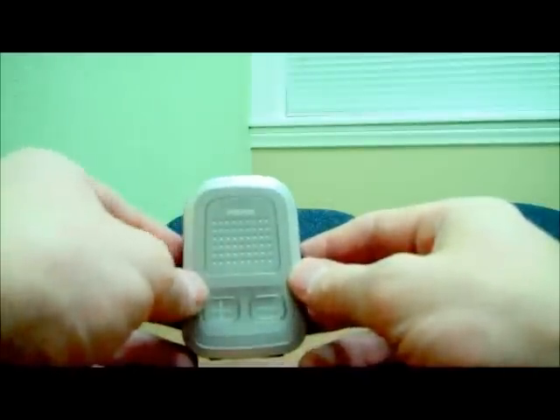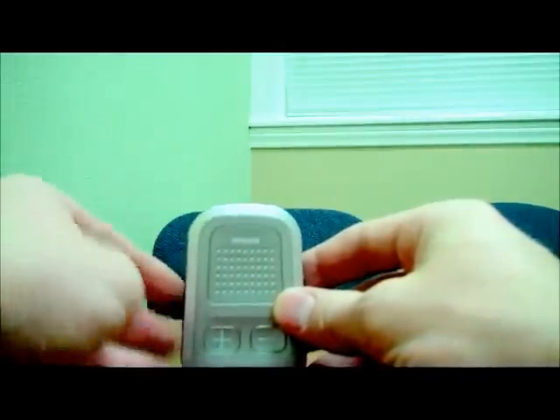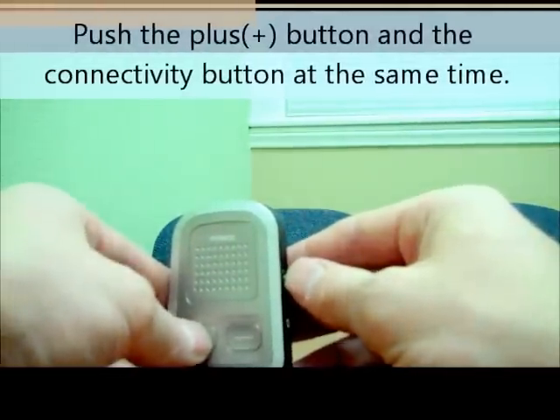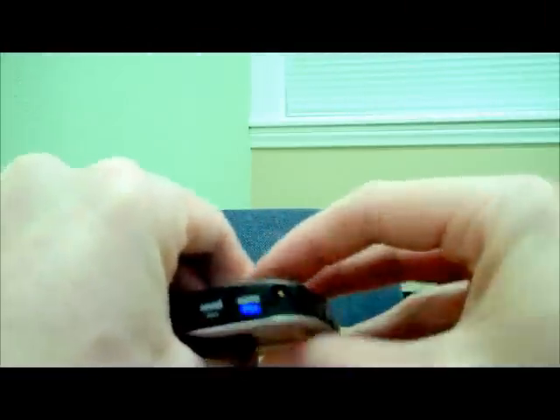So let's go through the pairing process first. The power is on. What I do is put this into pairing mode by pushing the plus button and the connectivity button at the same time. Hold those down for two seconds and you'll see that it's flashing blue.